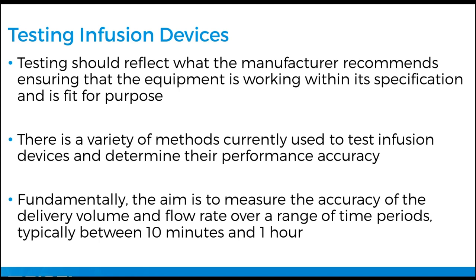How fit for purpose it is in regards to specification is open to interpretation. But if you're an informed clinical or biomedical engineer and you know metrology and you know how to calculate flow rates and you know what accuracy is and you have traceability back to national standards, then the choice on how you determine accuracy and traceability back to the national standards for quality management system purposes is entirely up to the healthcare organisation. There's a variety of methods currently used to test infusion devices. I'm going to go over some of them.